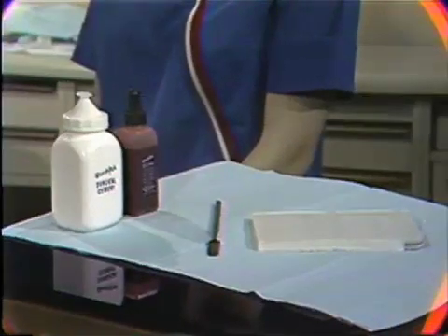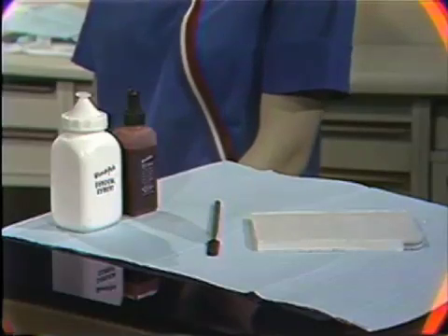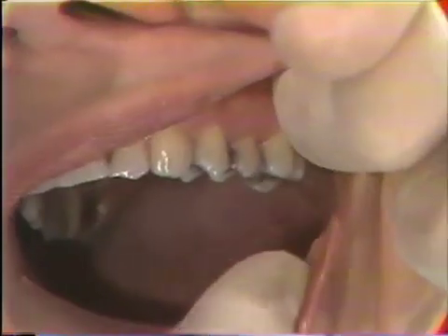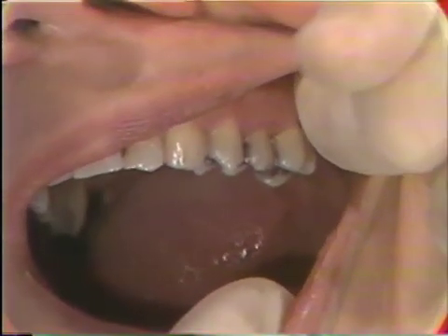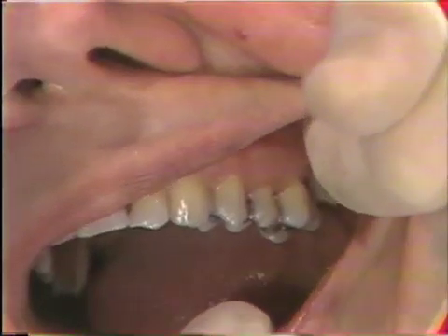In the mouth, we're going to be placing a dressing in the upper left quadrant. It will be around the maxillary left molars and the second bicuspid.